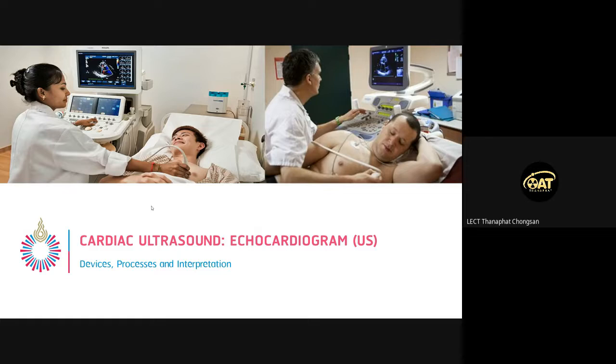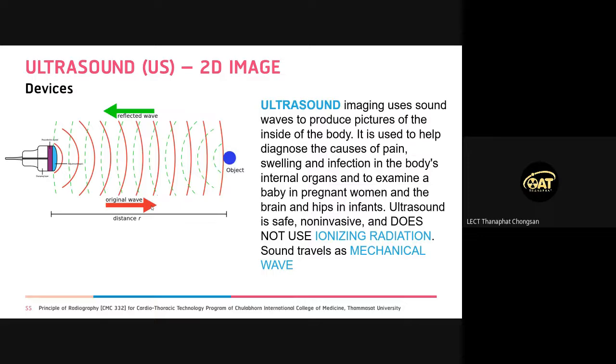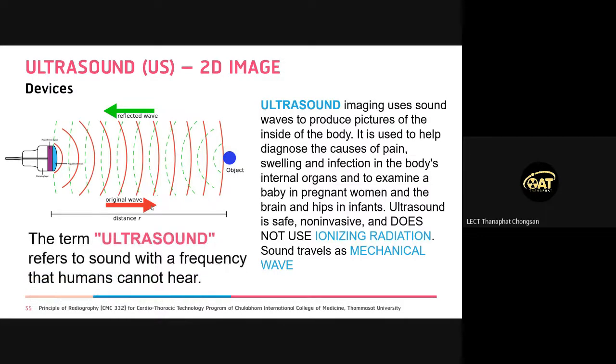This topic is necessary for everyone: ultrasound or echocardiogram. Ultrasound is a kind of radiography that uses sound waves to create an image by using the echo phenomenon. Everyone has learned this in previous weeks. Okay.